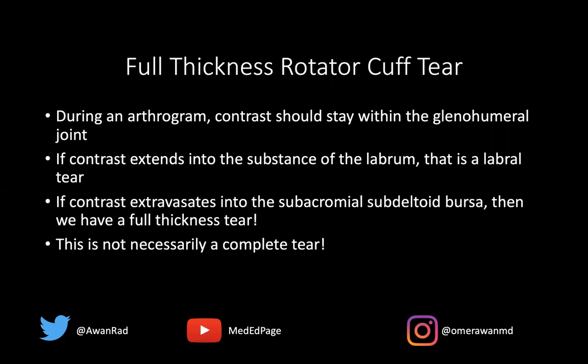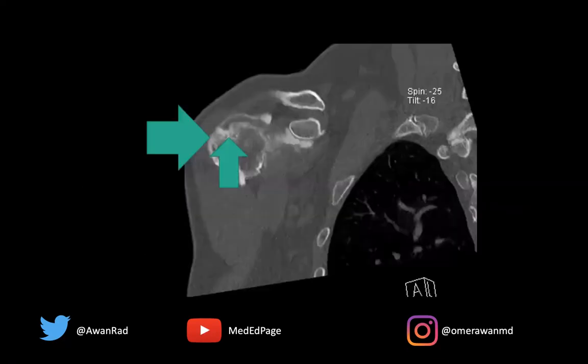This is not a complete tear because the rotator cuff is a three-dimensional structure. It has a thickness, which is the craniocaudate dimension seen in the coronal plane, and it has a width — an AP dimension seen in the sagittal plane. We know nothing about the width based on the image shown, so the best answer here is a full thickness rotator cuff tear.